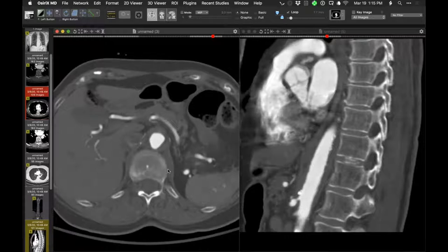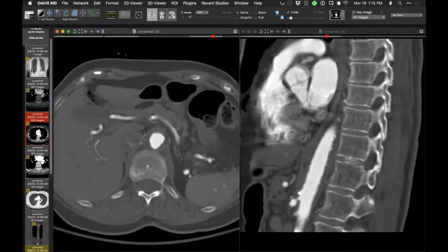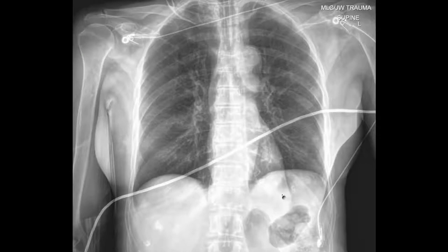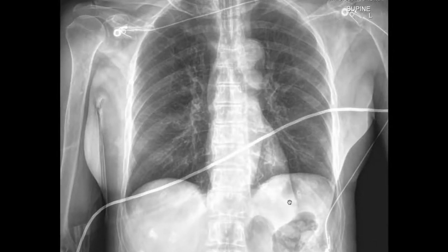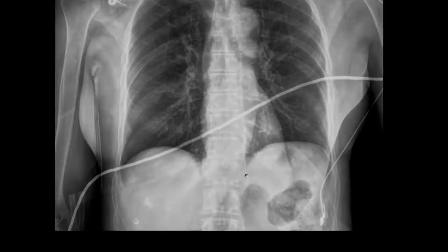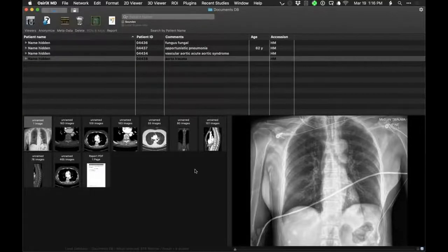Was there a radiograph that shows any widening of the paraspinal interface? No, this is pretty small, so I'll put the radiograph alongside it, but there's no way one can perceive for sure anything on the radiograph. No, agreed. Even though you wonder if there is a little something there, as it intersects the diaphragm, not that anyone would ever call it. Exactly. Okay, so yeah, we called it that.